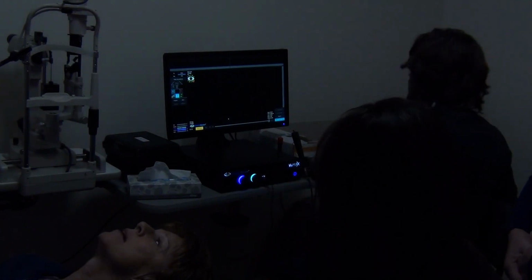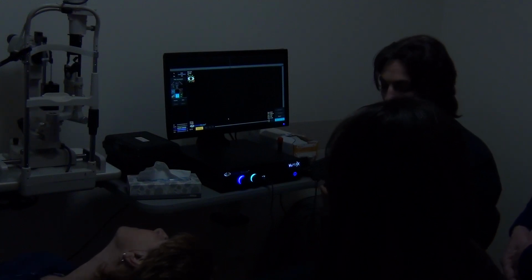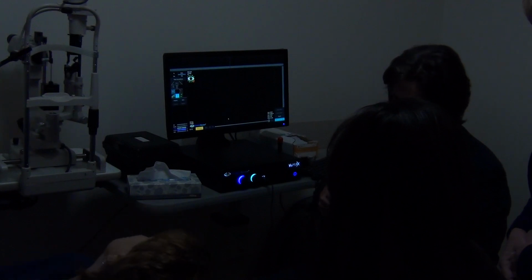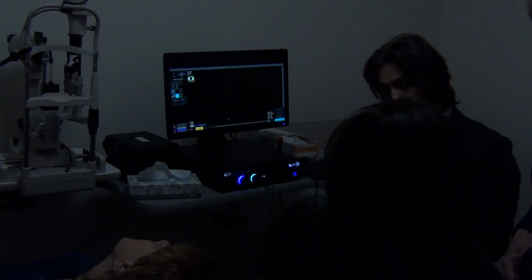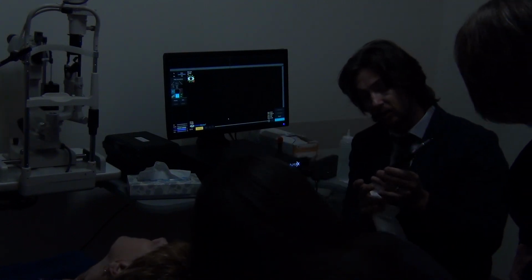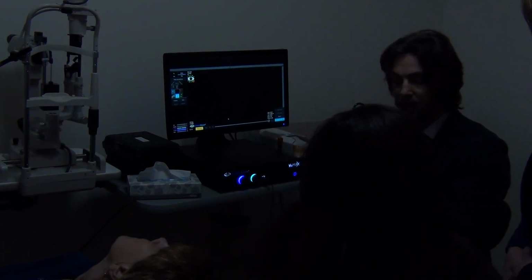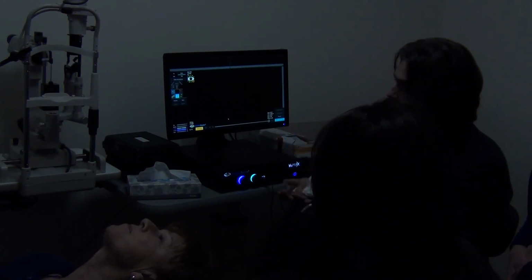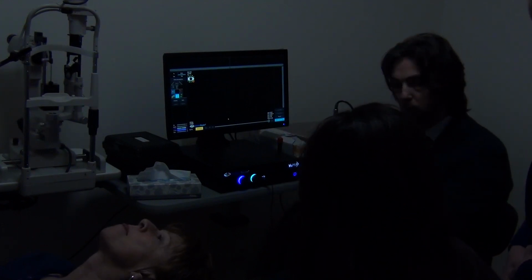Of course. So when you hold the probe itself, the crystal is open. There is always a fear to touch the cornea with it. I usually hold it as close as possible with my fingers, like this, up to this line. So when I rest the probe on the shell, my finger is rested, and I have full control. I will never go too deep. I can control how deeply I need to go, depending on the scan. Remember, if you scan in the angles, you need to be further away from the eye. When you do sulcus to sulcus, you need to be a little bit closer.